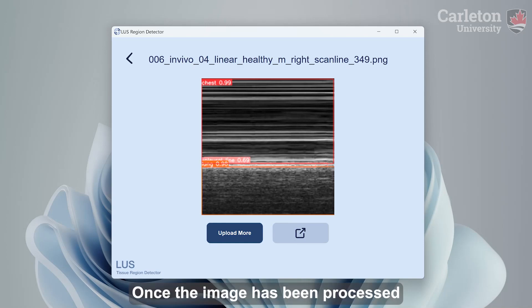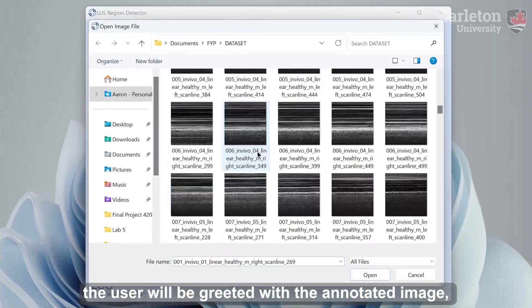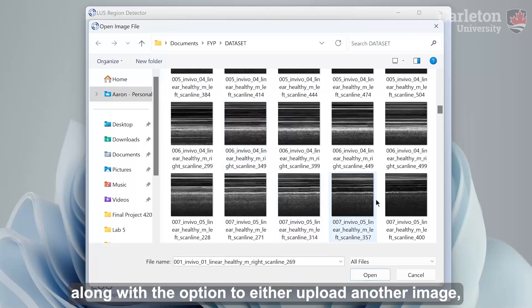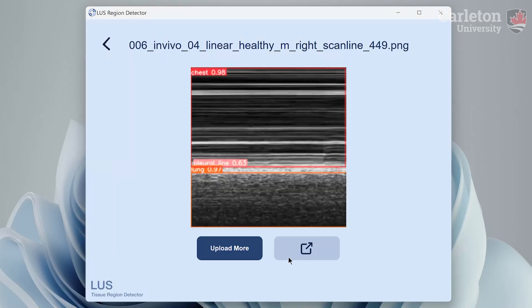Once the image has been processed, the user will be greeted with the annotated image, along with the option to either upload another image, or take the image they just uploaded to the export screen.